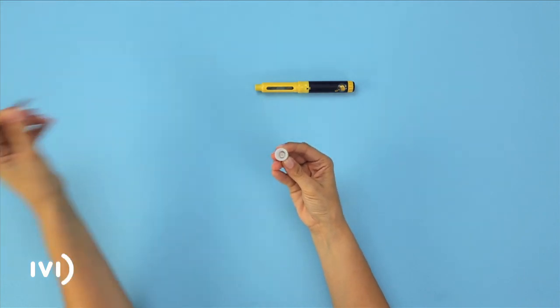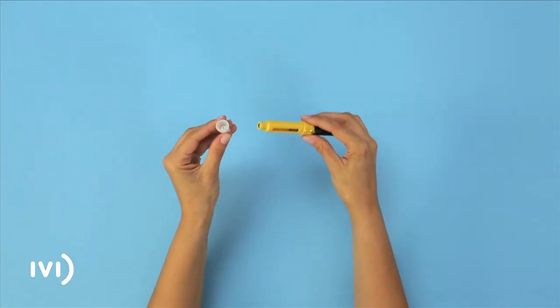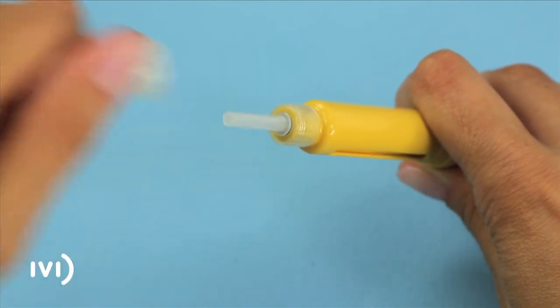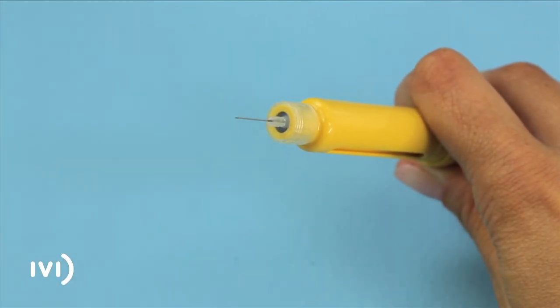Take a needle out of the box of medication and unwrap it. Next, attach the needle by screwing it onto the end of the yellow base of the pen. Carefully remove the external cover from the needle and then the internal protection.